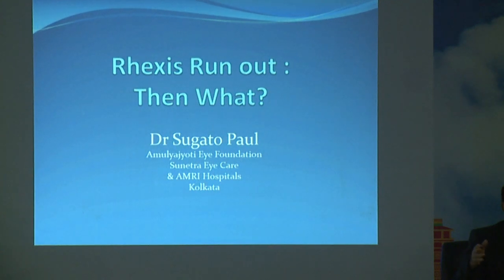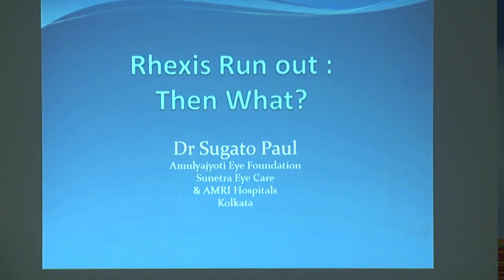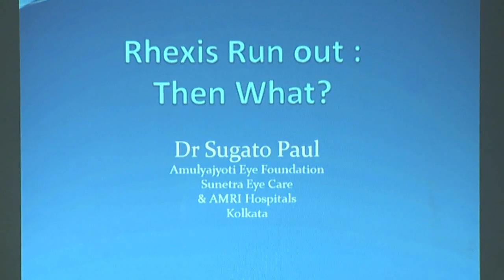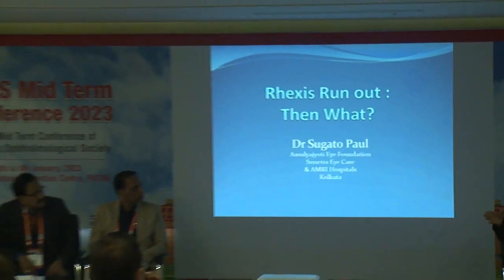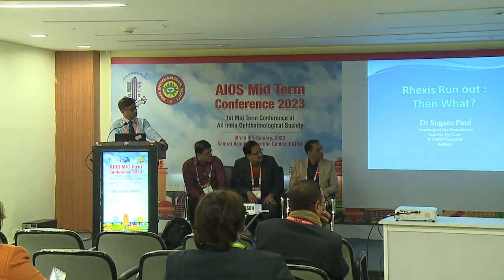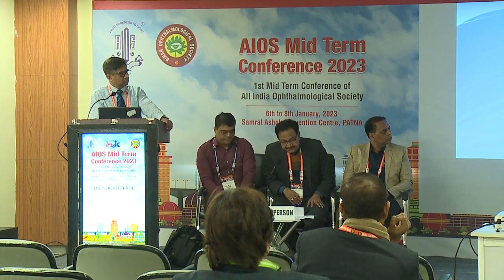But if you are using the monofocal like Eyhance lenses, or a pure monofocal, or EDOF lenses which have only intermediate vision like Symphony, Vivity, then you can go for the first minus if it is more than 0.33, or second minus which is more than 0.33. So below minus 0.5, around minus 0.3, minus 0.4.